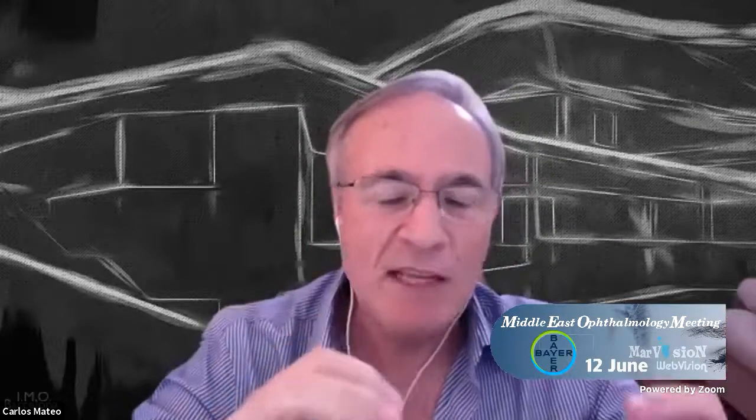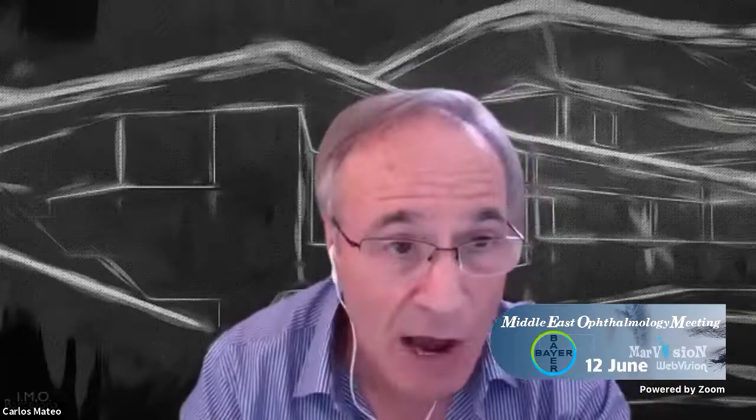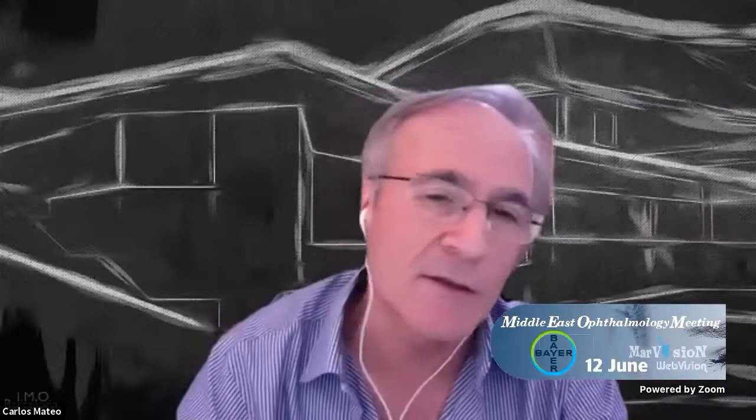Yeah, with the perfluorocarbon liquid, you have a big problem because it's very easy to have bubbles. But if you don't elevate the tissue, you won't have perfluorocarbon liquid under the graft, but you can have some bubbles of perfluorocarbon liquid. I had in the last case some bubbles in the subretinal space. At the end of the surgery, you have to be sure you don't leave any bubble under the retina. Thank you very much, Dr. Carlos.